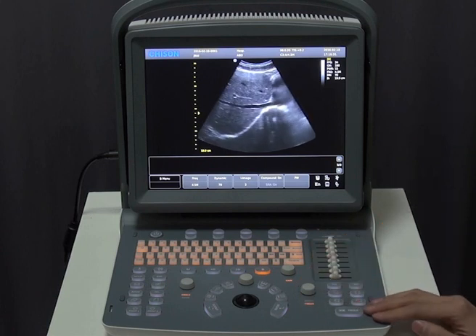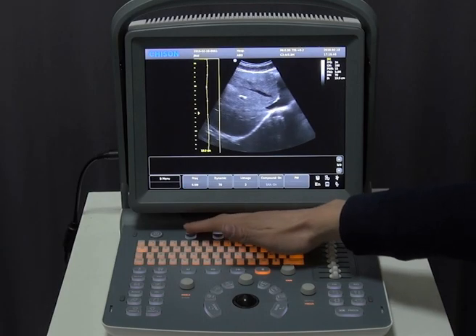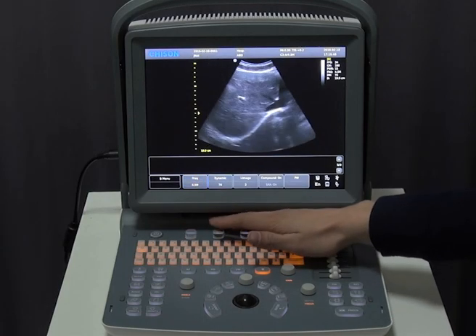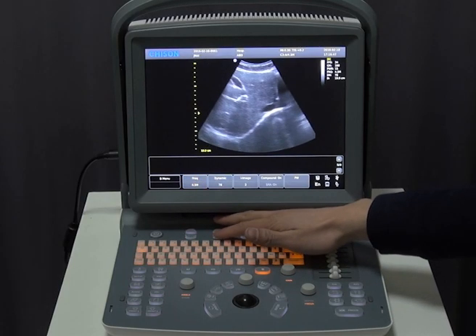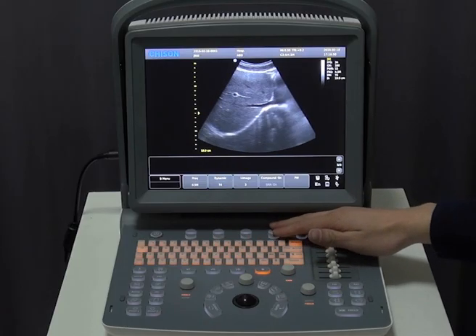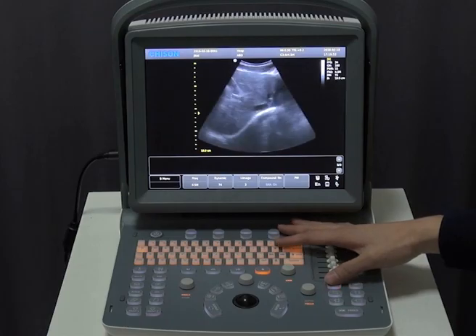Up top, we have our image optimization controls. Here we have frequency, dynamic range, THI, eye image, and spatial compound. Press these buttons to get a different value.